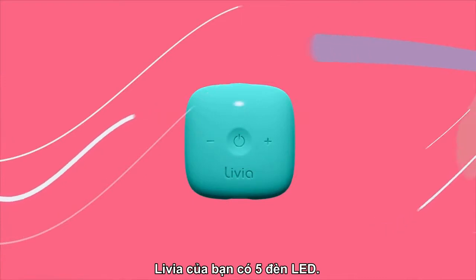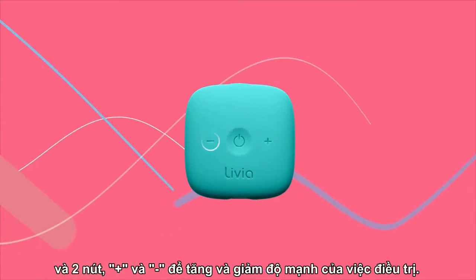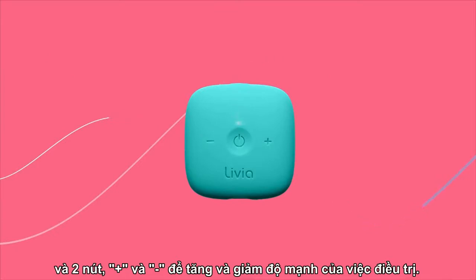Your Livia has five LEDs, one power button in the middle, and two buttons — plus and minus — for increasing and decreasing the strength of the treatment.